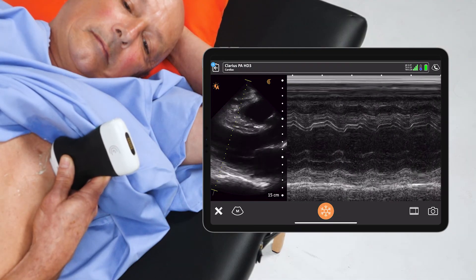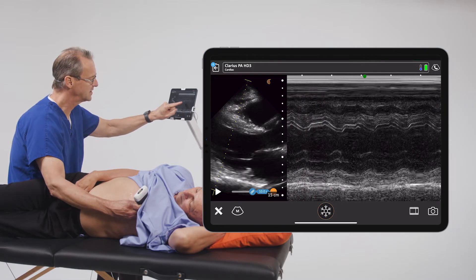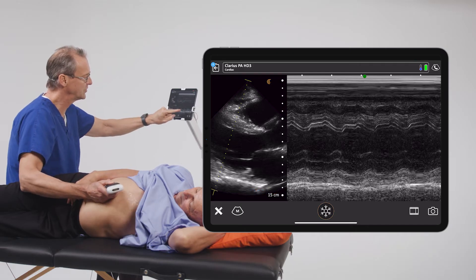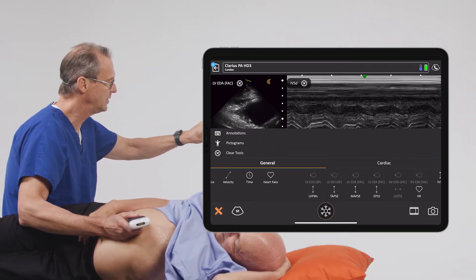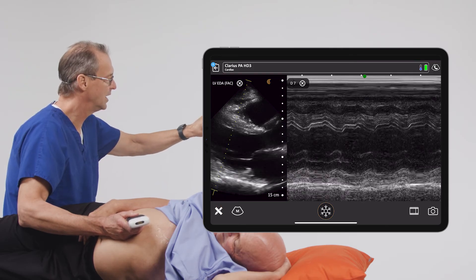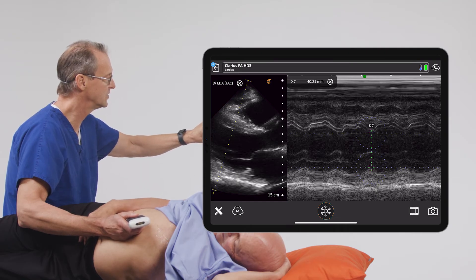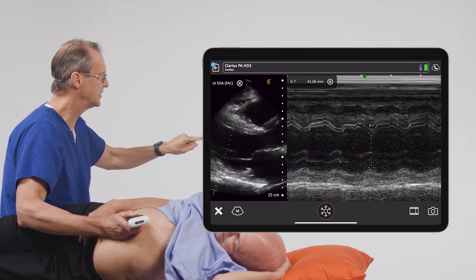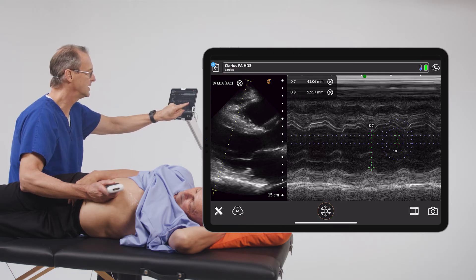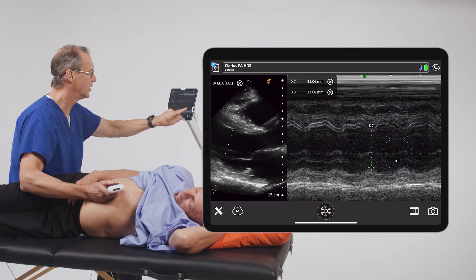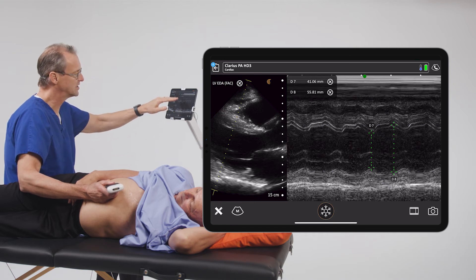Let's get a nice good tracing and go ahead and freeze that image. We'll look for an area where we can measure the distance between the interventricular septum and the posterior wall at the end of systole and the end of diastole. Now we're going to go into our measurement menu and choose vertical distance. We'll go ahead and measure the heart at the end of systole and see that those two structures are right around 41 millimeters apart. Then we'll get a second vertical measurement in diastole when the heart is full of blood, and we can see that measurement is about 56 millimeters.